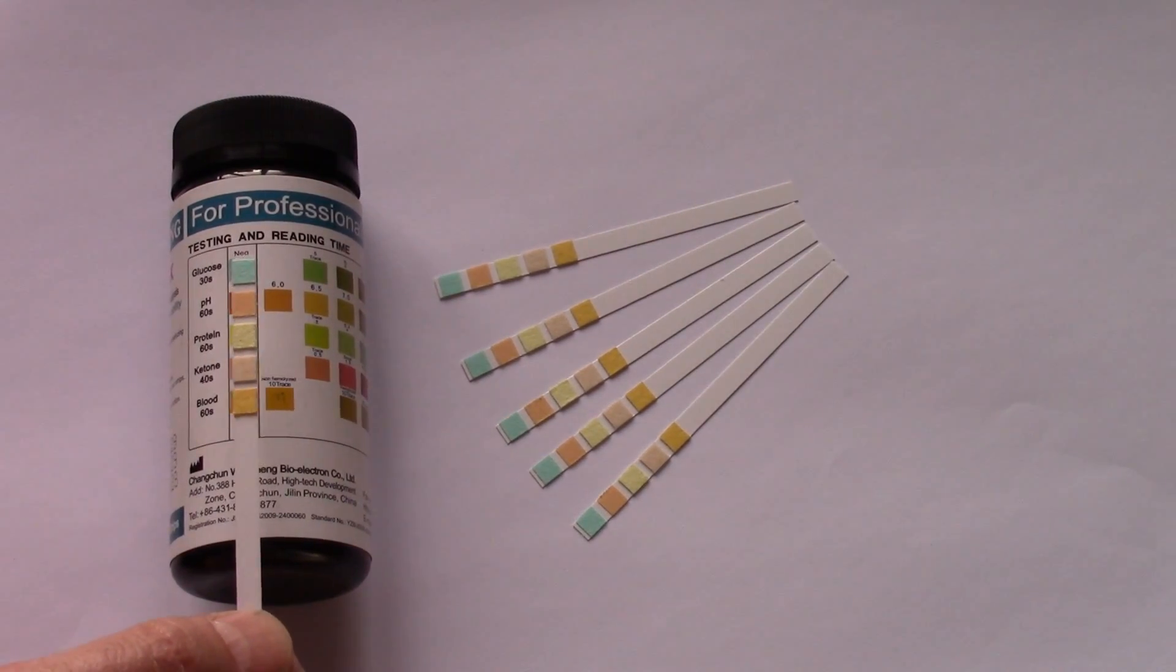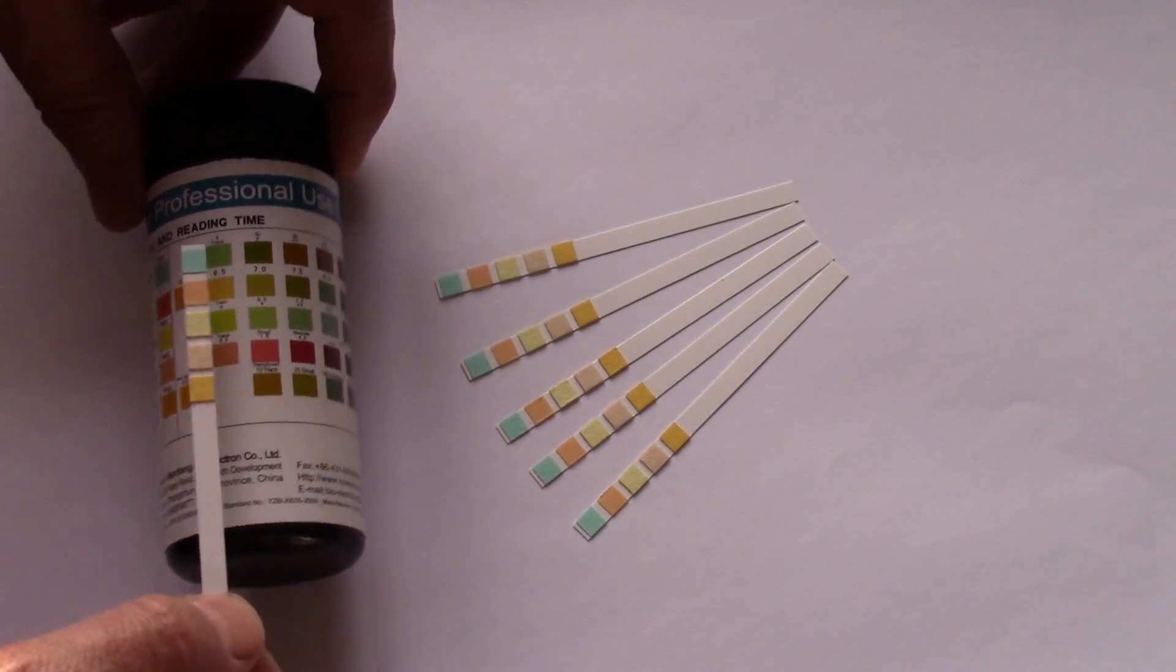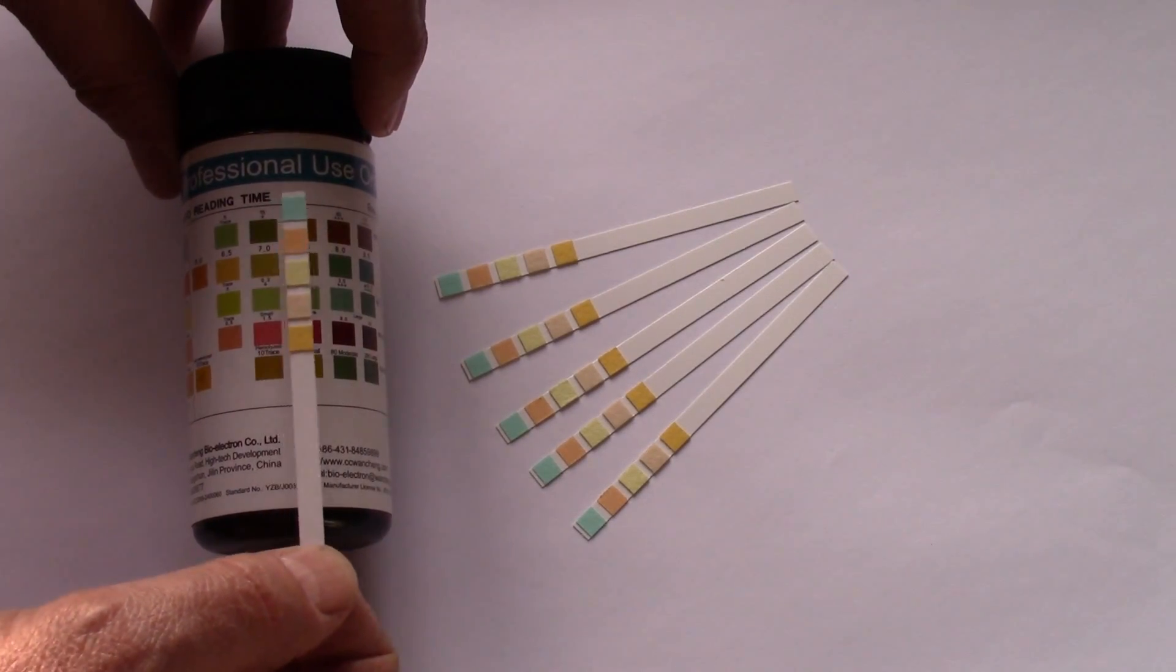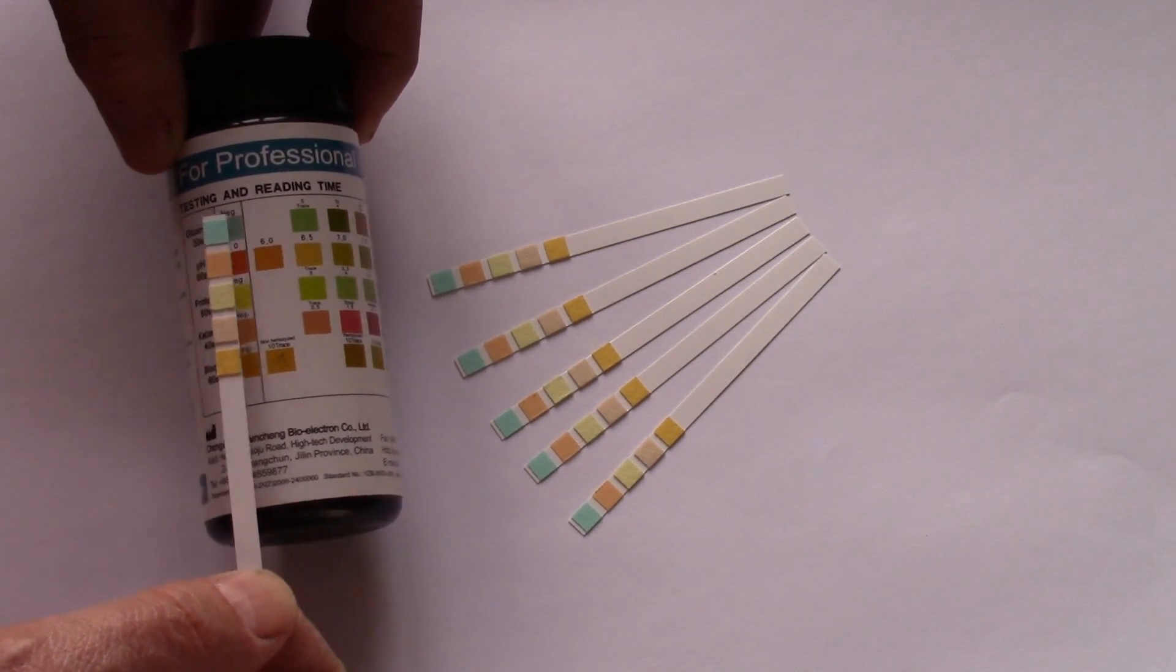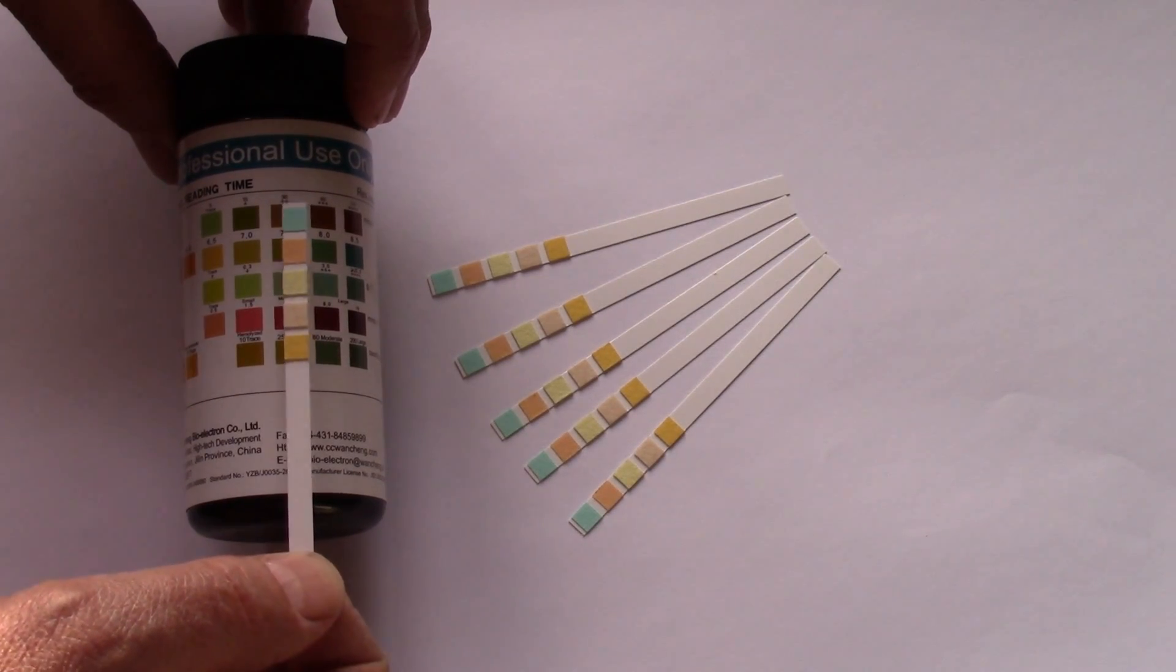So you do need a timer as soon as you start finding any abnormal results. You are comparing the color against the row at the specific time for that parameter and making a note of the level.